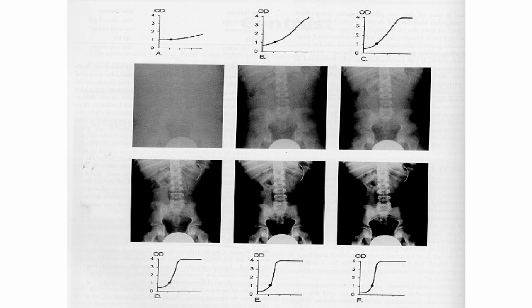So, gano'n. Yung importance ng contrast ay pinakikita dito sa mga images na to, especially when we are looking for a specific disorder or specific diagnosis.